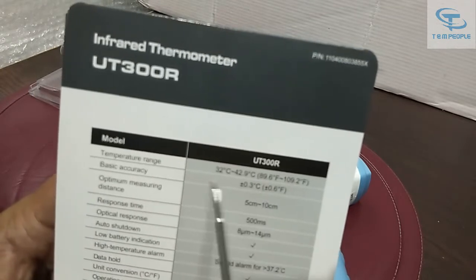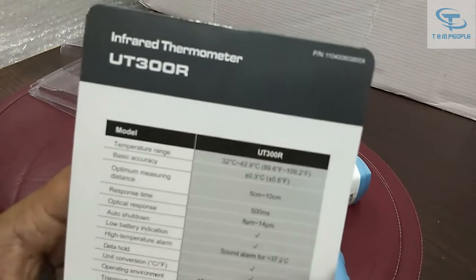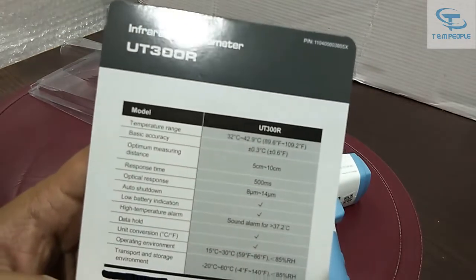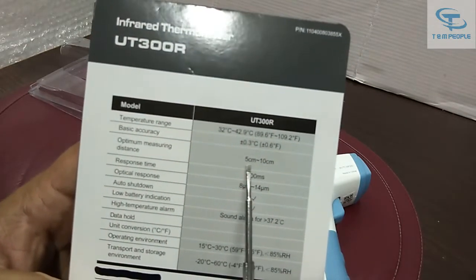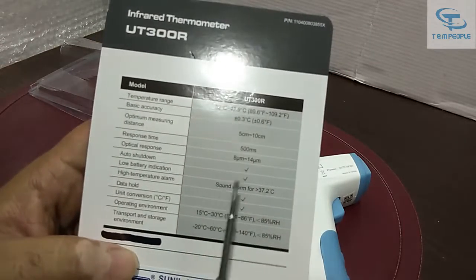If the reading goes below this range it will show 'low', and if the reading goes above it will show 'high'. The basic accuracy is 0.3%, which is very good. The recommended distance is 5 to 10 centimeters to keep and check the temperature of a human body.